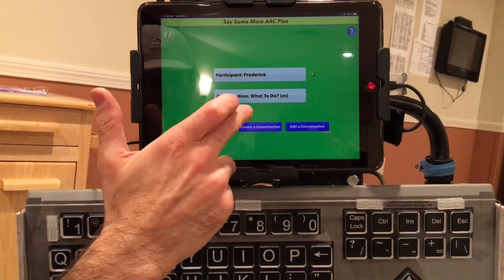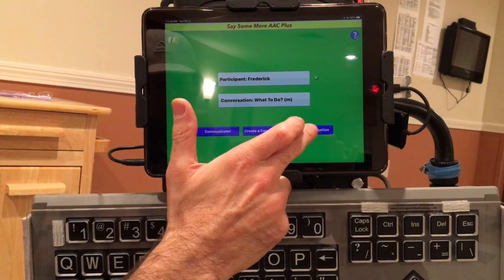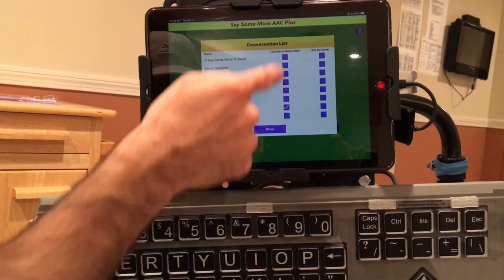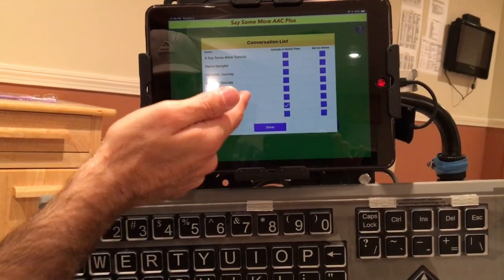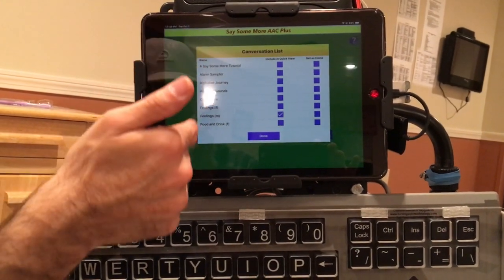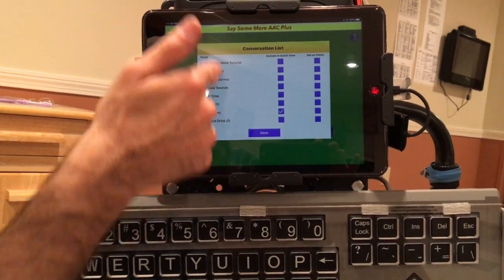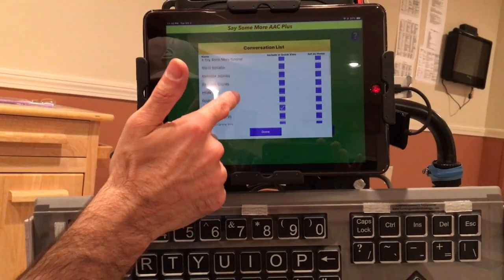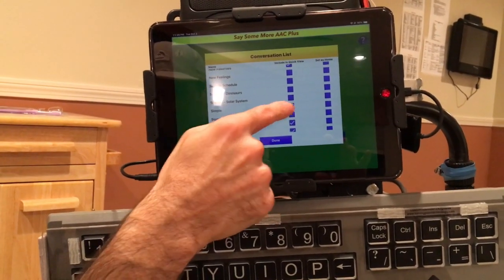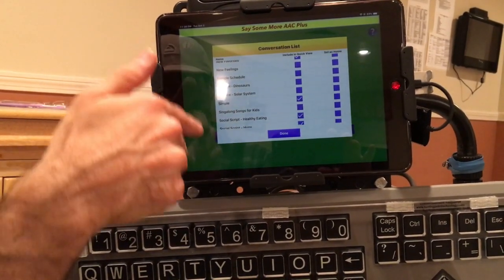So you have to exit from here, and what you have to do is click on the conversation. This shows you which ones are going to be viewable. This isn't sortable. To put it in order, you have to rename all the conversations like 1, 2, 3, a number before the conversation, which we'll probably end up doing to do it in a custom order, because it's just going to default to alphabetical order here. But let's scroll through. The new conversation, simple, here it is. We clicked it, including quick view. There we go. Now it's going to be visible on that list of conversations on the left.